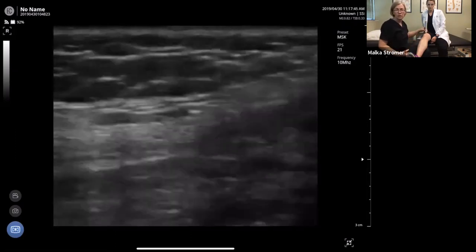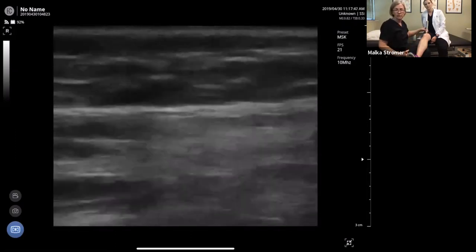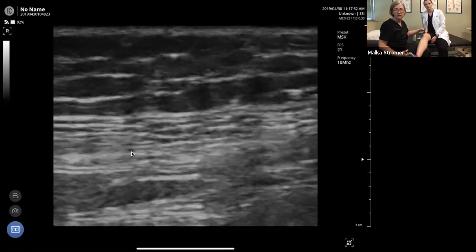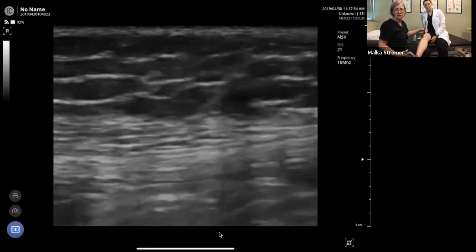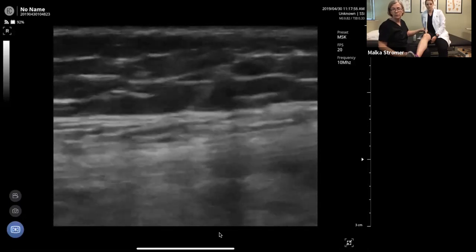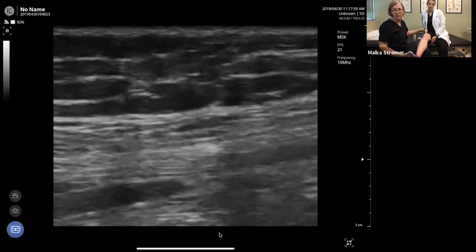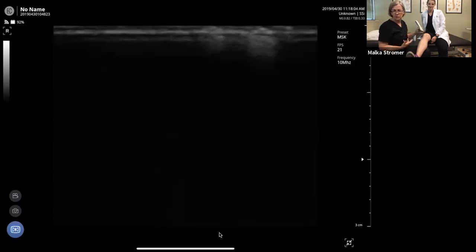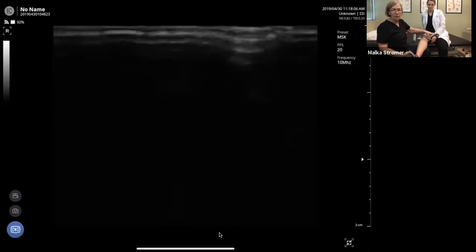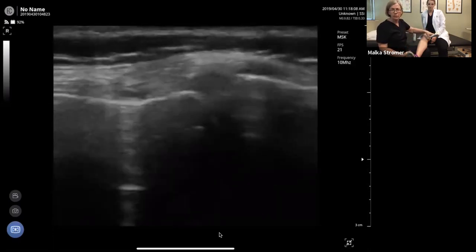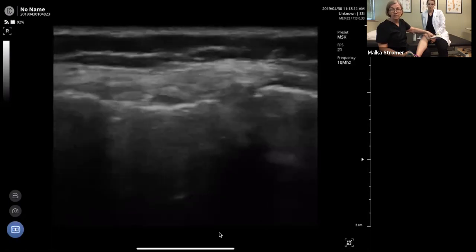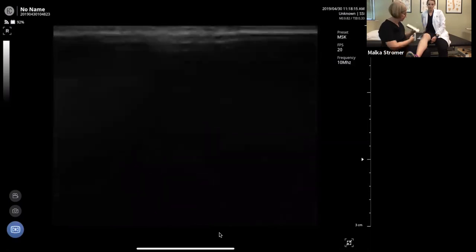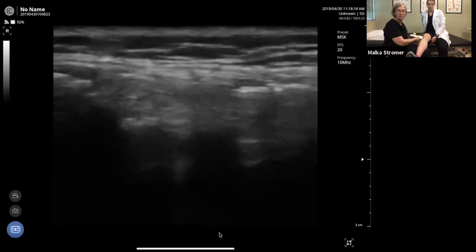Going back into long axis view — there is your quad muscle. Tighten that quad and watch it move. The beautiful part of musculoskeletal ultrasound is always the dynamic movement — you can see what's going on in real time. Generally, if there's been any pathology, I like to go back with the knee in flexion and look again medially and laterally just to see if anything got missed.